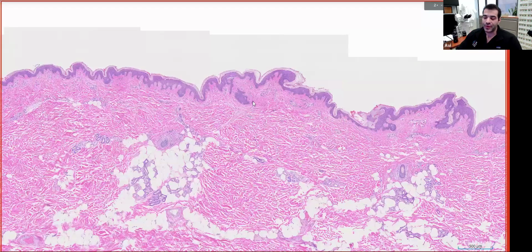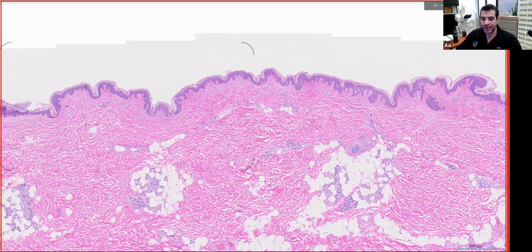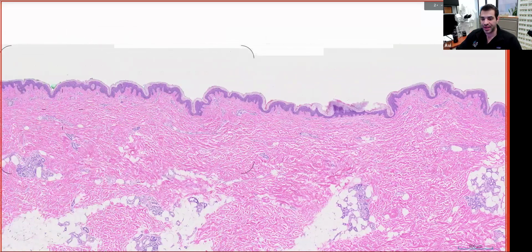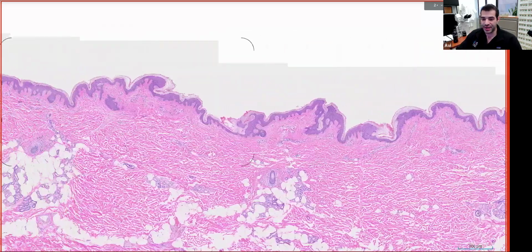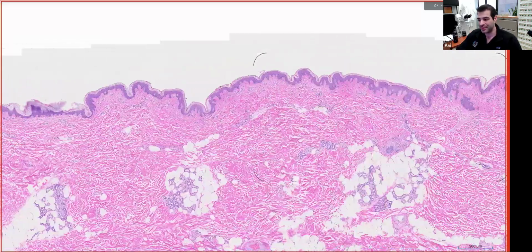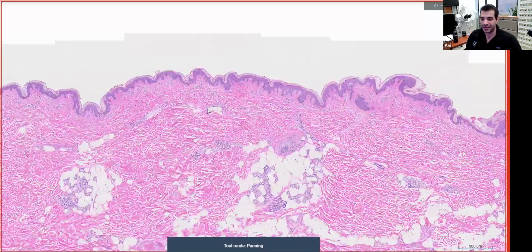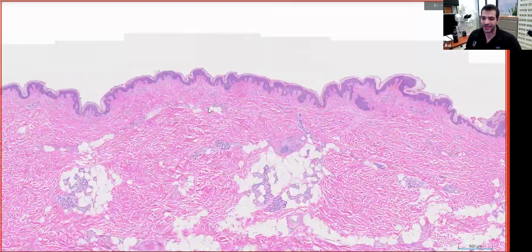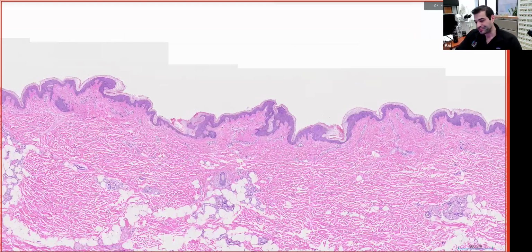So what can we do? Well, one way of clickless panning is to do this, where we have a system where if we move to one side or the other, we can pan, but this is very inefficient also. This is slow, and even if we make it fast, it's too clunky. It's not really an efficient process. Some people have tried using their keyboards. So this is a keyboard pan. Same story. I still have to click, click, click, click, and then it's also clunky. It's clunk, clunk, clunk. So it's not smooth.